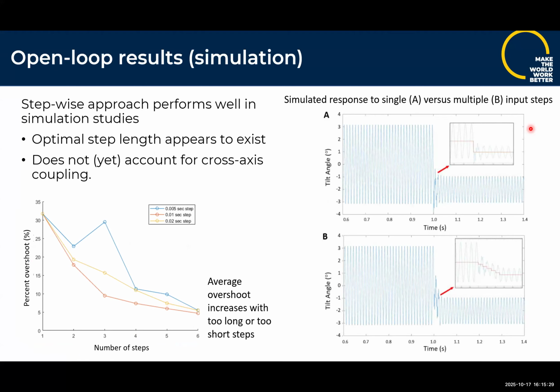There are trade-offs he finds between overshoot and the number of steps, but you can do some things like, this is some simulated motions where you can keep a pretty fast transient motion to the new scan pattern, where a direct step would have caused overshoot into an unsafe range potentially. He can smooth that out without losing too much total settling time.